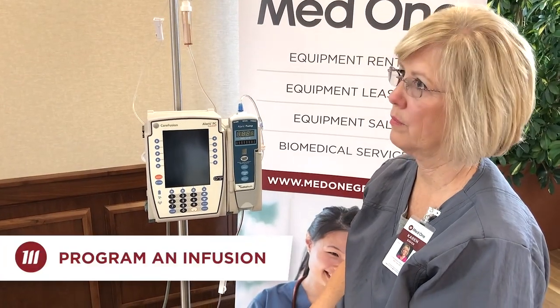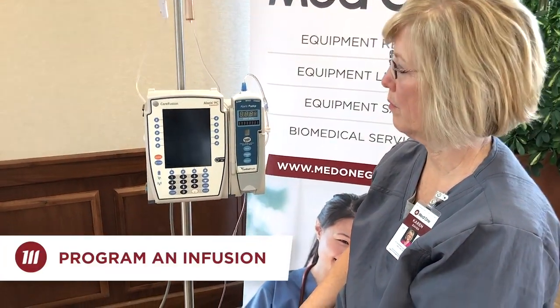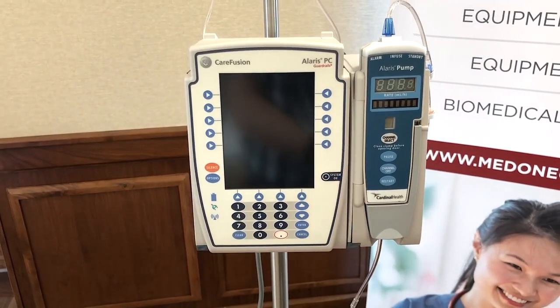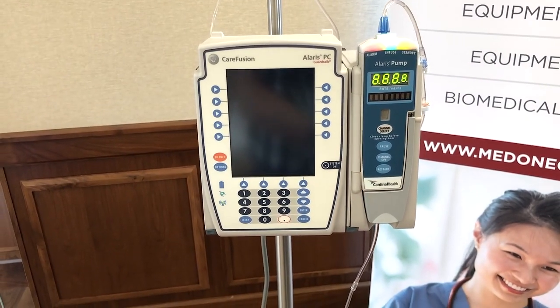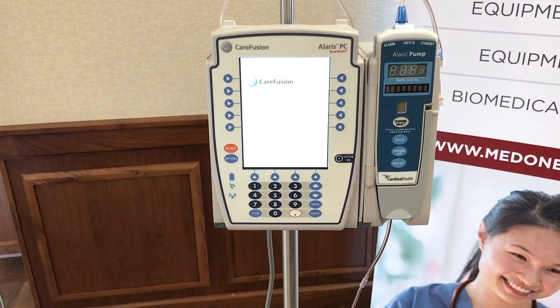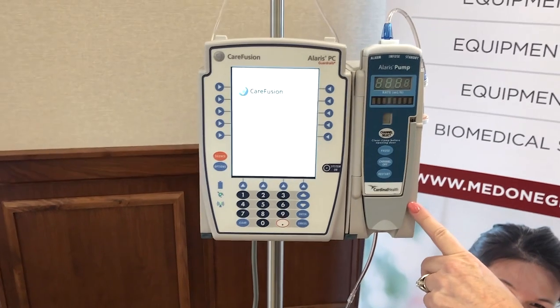Now we're going to program an infusion. The clinician will reach out and power on with the system on button, and it will go through a series of diagnostics so that we know connectivity has been made between the Alaris large volume pump module and the PCU.